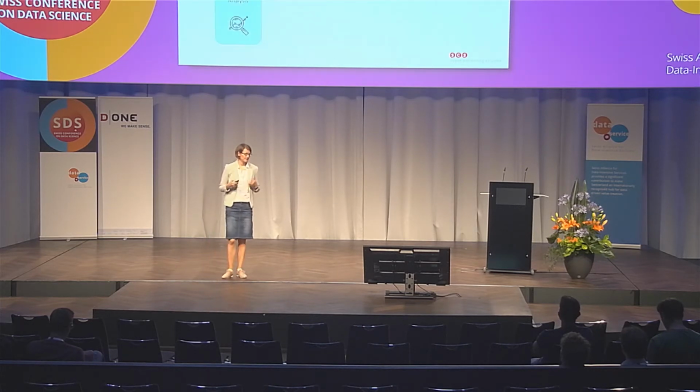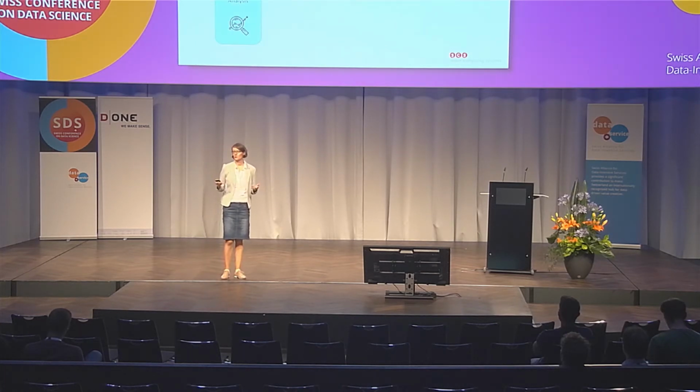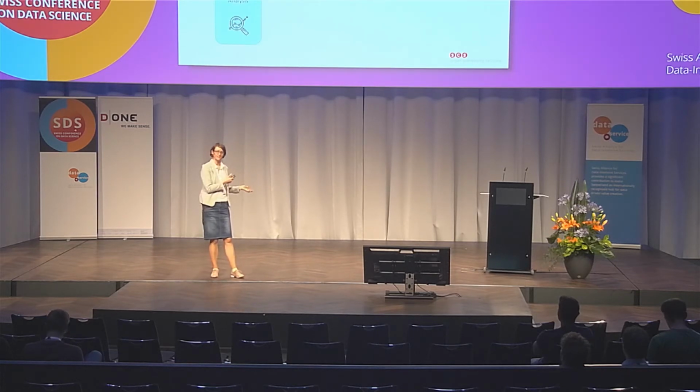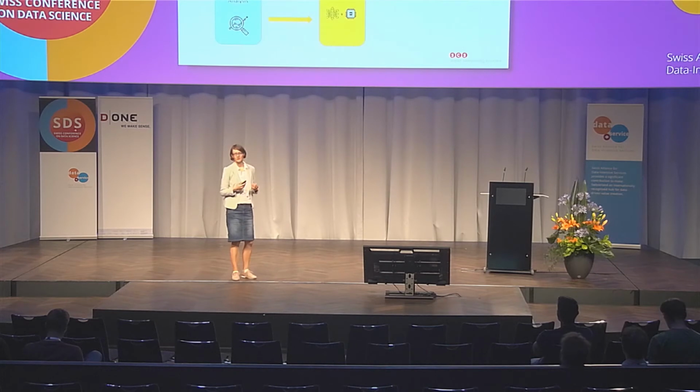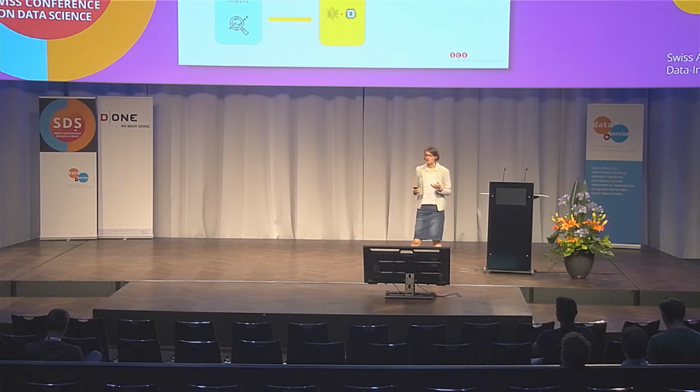Now, the second part, or let's say these components were still local, and for us it was important that the ophthalmologists can access these tools, but they are not used to work with GPU servers. They need some sort of an interface, and that's why we deployed it to the web. The second step was the deployment, where we actually have a backend that does the CNN prediction and the analysis.